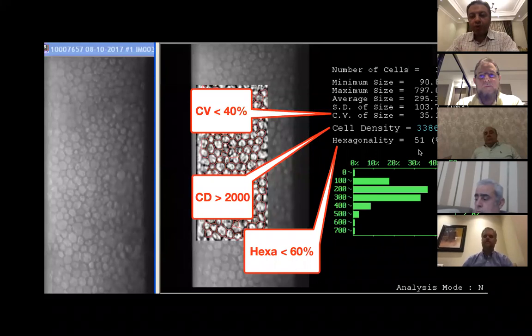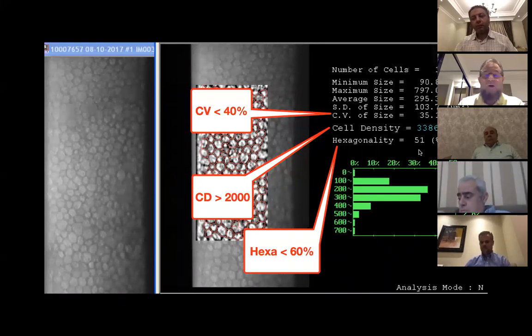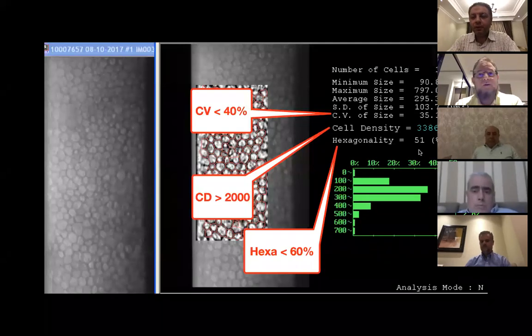And when to decide to extract it is a difficult decision, but I have to do it at the suitable time before losing the cornea. So what changes will help me to take this decision? Very nice point. I don't know actually. If you can tell us, please.